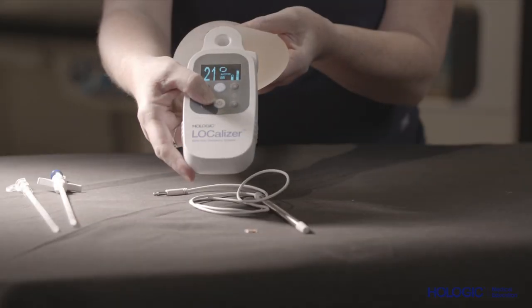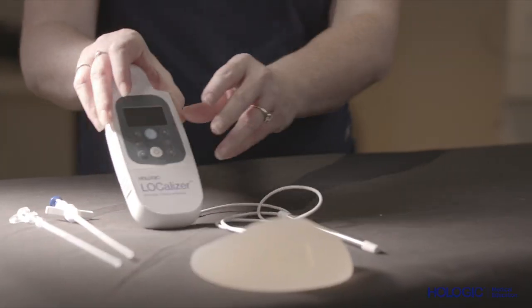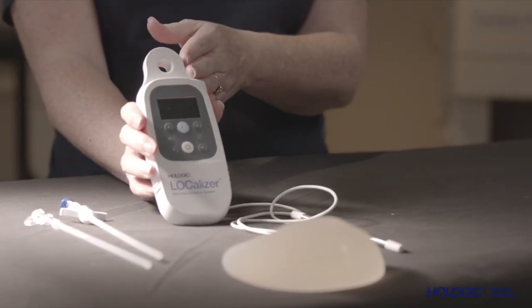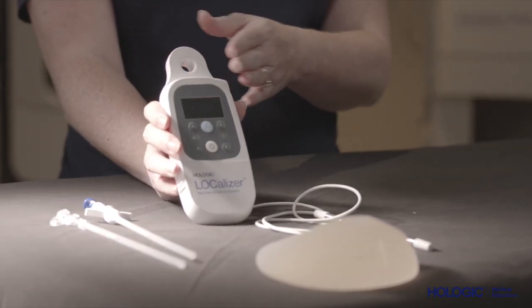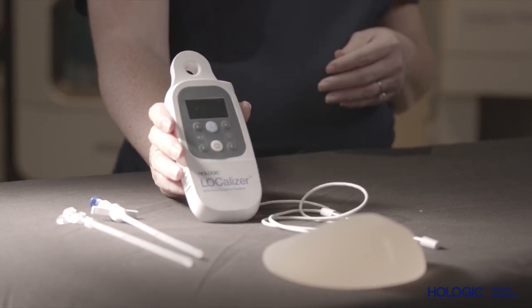It can be used on the skin surface in non-sterile environments or draped in the sterile field. There are two detection probes. The first is a loop probe integrated into the reader itself. This probe can be used by a radiologist or surgeon to confirm placement of the tag.